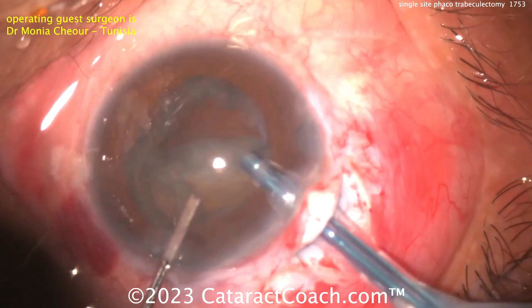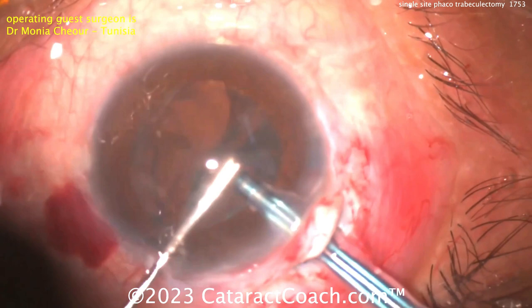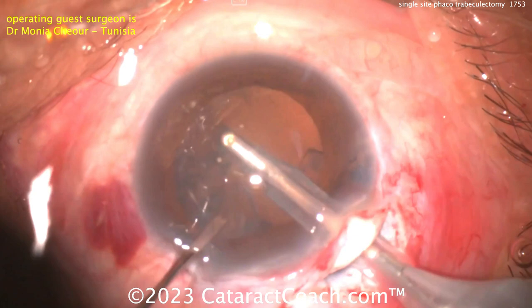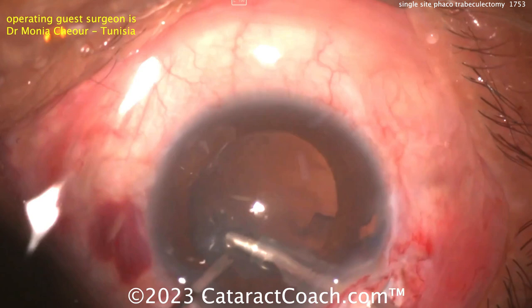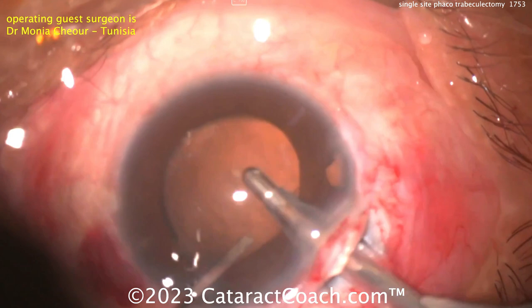There's the nucleus being split and pieces being removed pretty nicely and straightforwardly. A little chop technique there with the second manipulator instrument — you can chop with any instrument, it's just all about the technique. Now taking out the cortex here — epinuclear shell — be very cautious. The last thing you need in a case like this is a broken bag and vitreous prolapse. That looks great — beautiful technique here. I want to say thank you to our surgeon for submitting the video. Cleaned up very nicely.